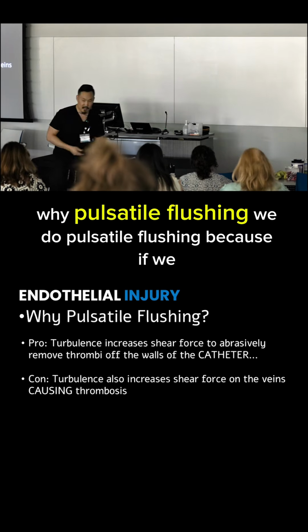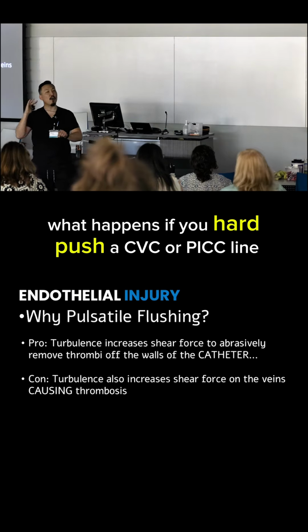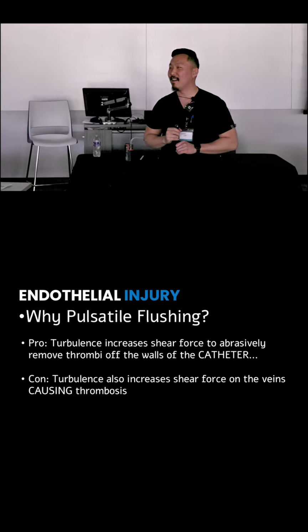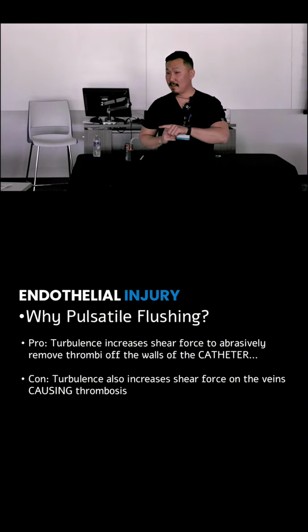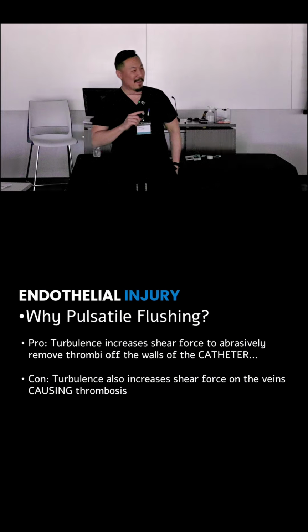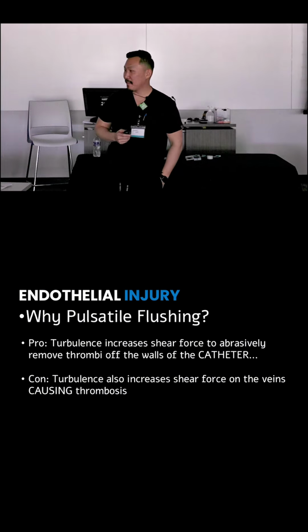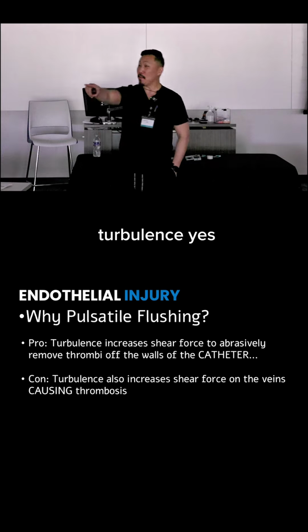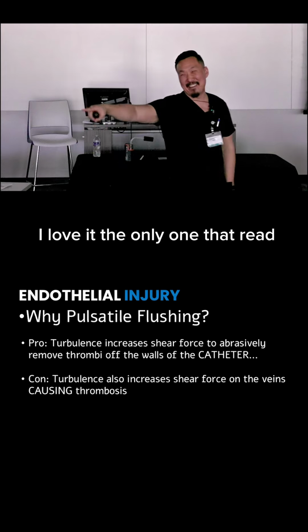Why pulsatile flushing? We do pulsatile flushing because what happens if you hard push a CVC or a PICC line? What does it do to the catheter negatively? But who cares? Turbulence, yes. I love it. The only one that read.